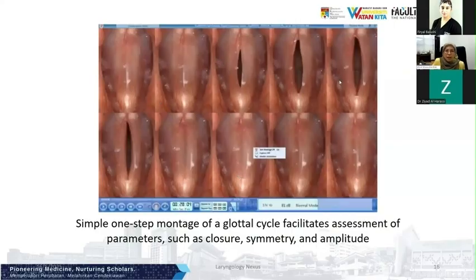You will get these 10 frames. These 10 frames are actually chosen of many frames. Of these 10 frames, you look at, in a normal phonating, healthy vocal fold, it should be either predominantly closed or half open, half closed. I've seen that many times in a normal vocal fold. So why do you say it's predominantly closed?